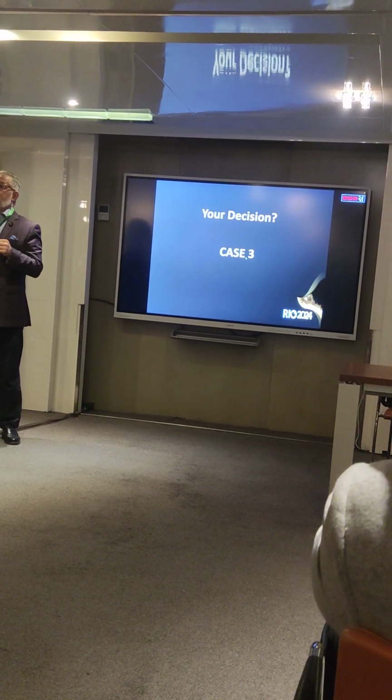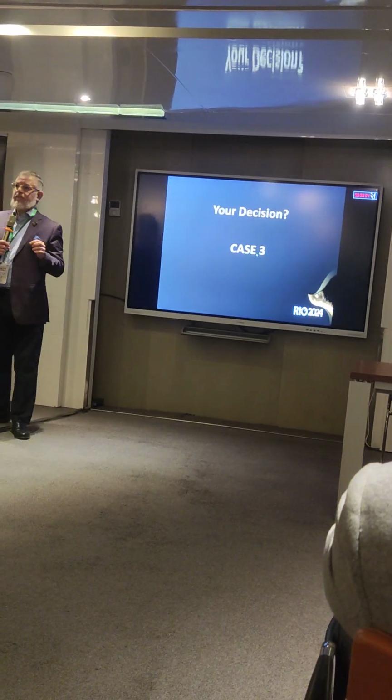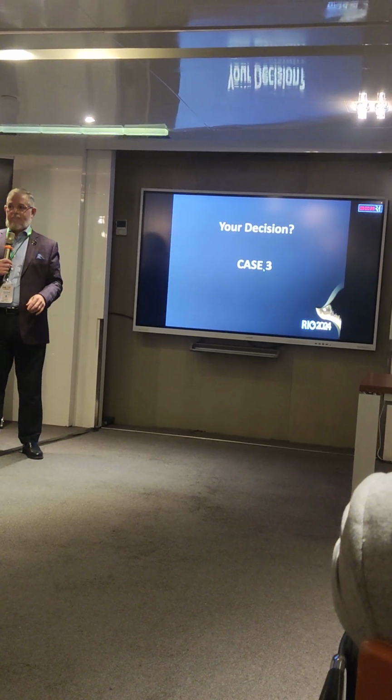Yeah, how about using a monofocal with zero spherical aberration, to keep the same spherical aberration? I have a comment. I was just going to tell you this.